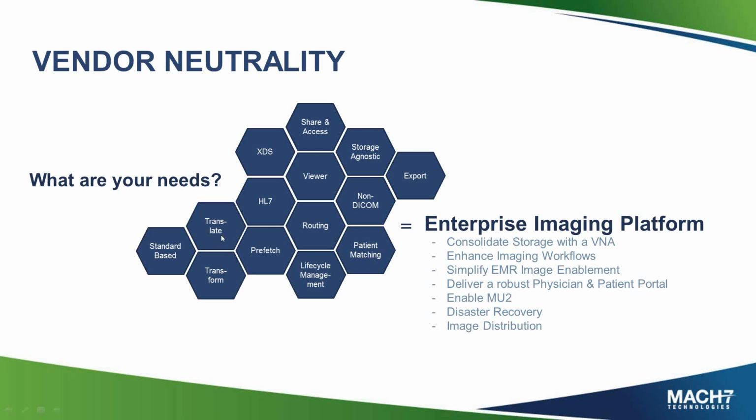From a translate perspective, as I'm bringing in outside imaging data, can it translate patient ID? Can it make sure accession numbers are not going to collide? Can it translate series and study descriptions? Maybe one department calls it CT head, but you call it head CT. Can it translate those kinds of things?